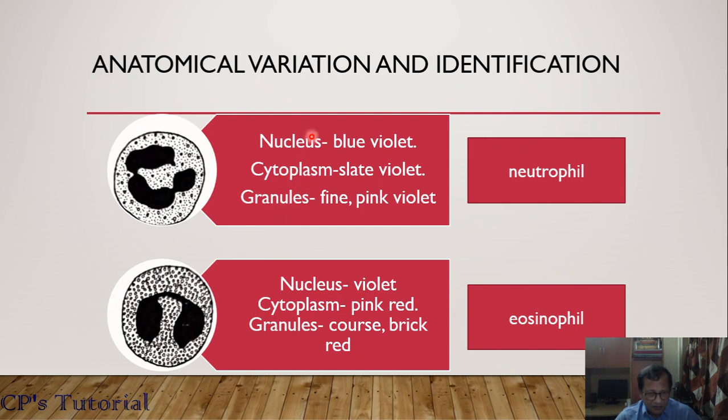These 3 characters are most vital. The colors have been created according to their cytoplasmic chemical reactions, and that can be checked under the microscope at 45x.